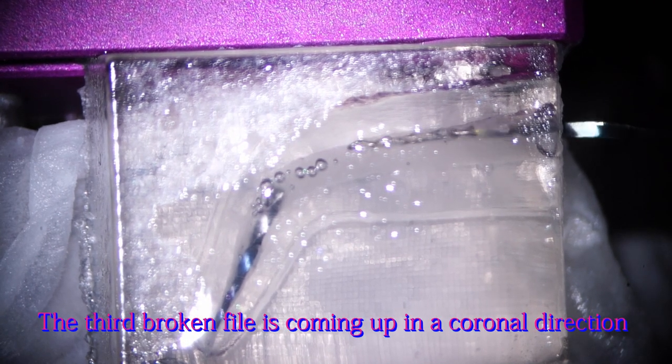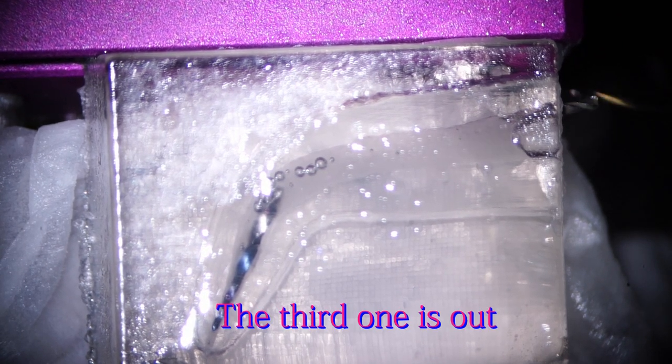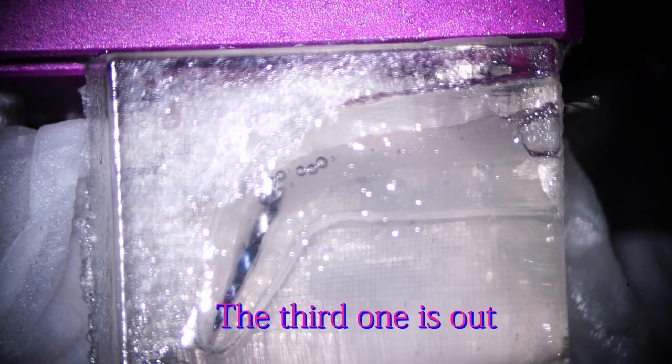The third one is already out of the curved canal, and the broken instrument is rotating together with the number 35-04 HIFLEX CM instrument. It's coming up in a coronal direction — it's already out. Continue rotating the instrument and the broken instrument is already out. So the third one is out.